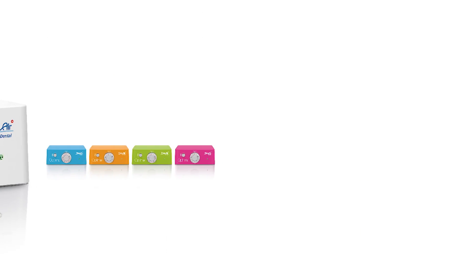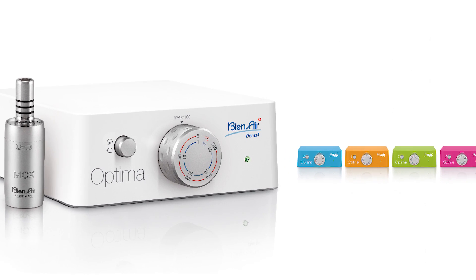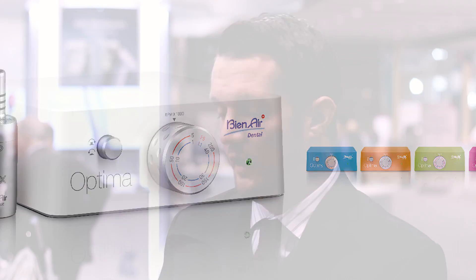The concept with the MCX motor system is simplicity of connection and simplicity of operation. It can connect to any dental unit — just any standard four-hole tubing — connecting right to the back coupling. So it's a modular system. You can order it and install it very quickly and easily. There is a very nice dial here which allows the user to switch from high speed to low speed, all with the same attachment. One button, one attachment, one system.